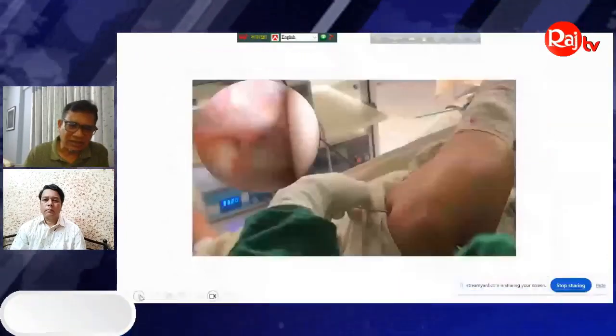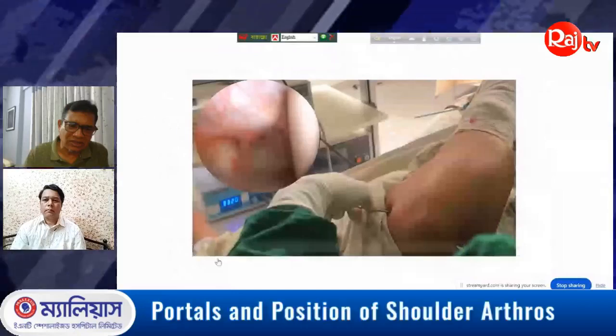We can see in a video the overall creation of portals.